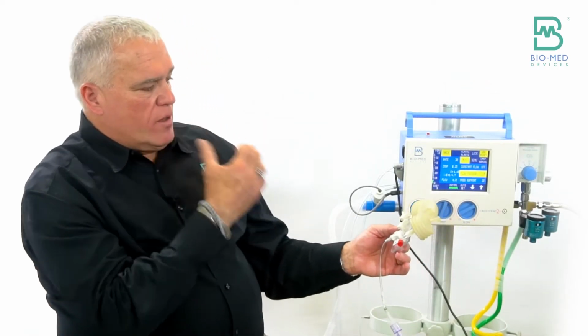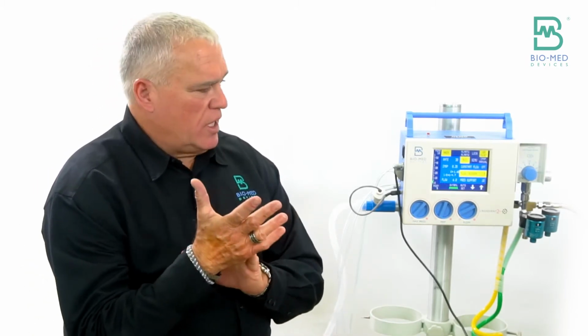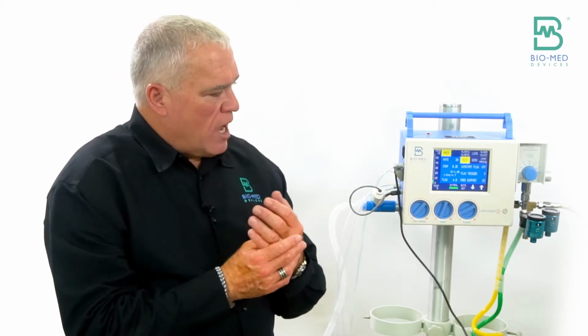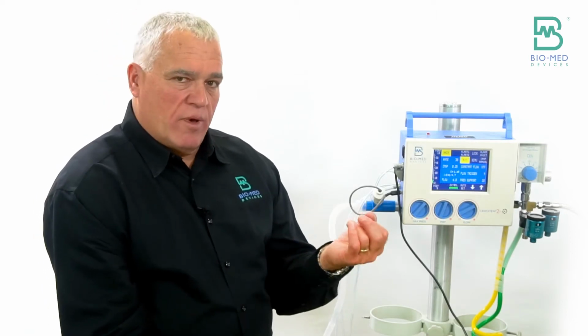One of the problems with transports is typically when the transport team is going to pick up a patient at a referral hospital, they probably don't intubate that often, and lo and behold, you get there and the tube has a giant leak because they got a 2.5 tube and a 3.5 kid. So you got a big leak. Most of the time, as long as the patient's being ventilated, you wouldn't change that tube out in the field. You'll wait till you get back.